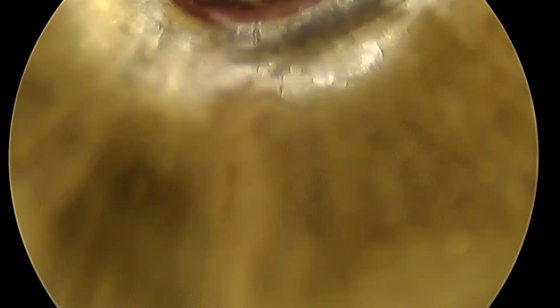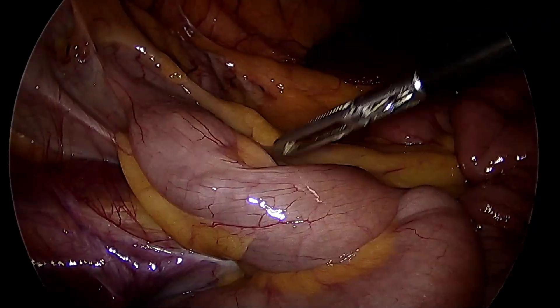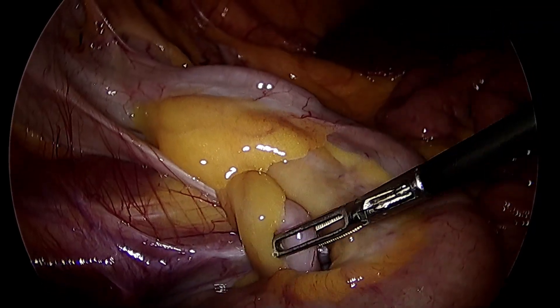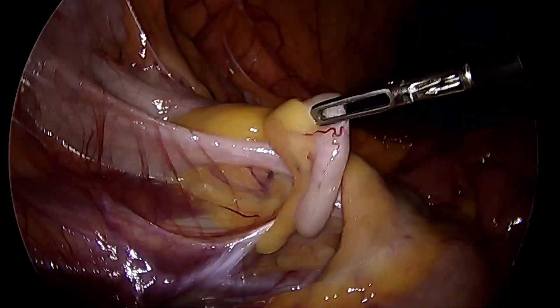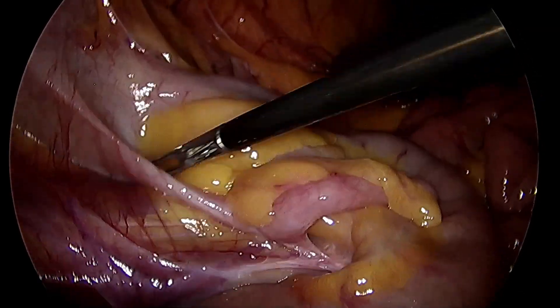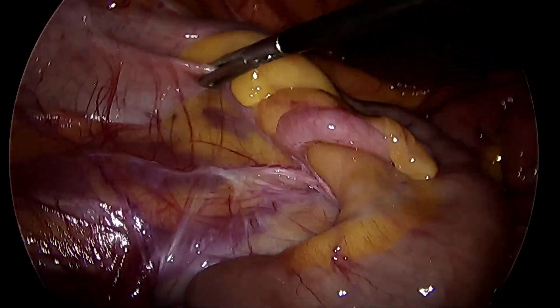I am playing the entire video at 2x speed. If you want to view it at its original speed, kindly play it at 0.5x and that will do the trick. As you can see, there is the appendix — the adhesions are a sign of past infection.